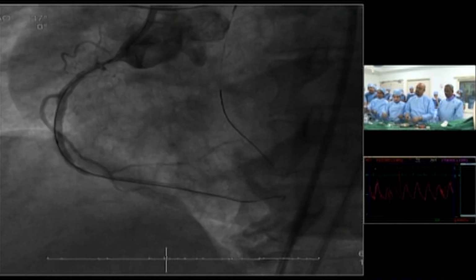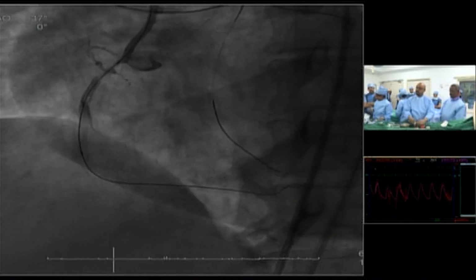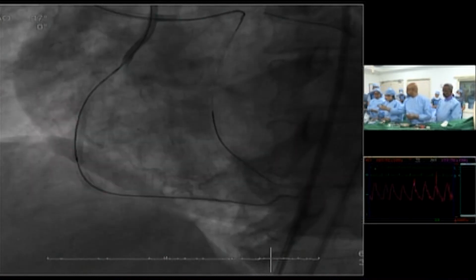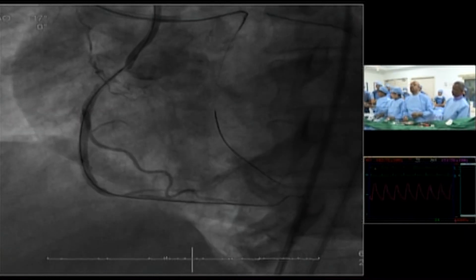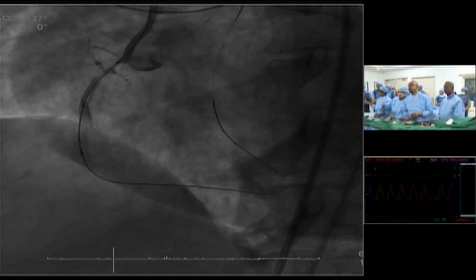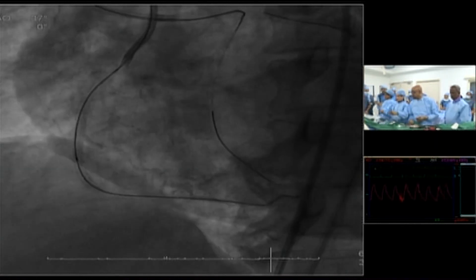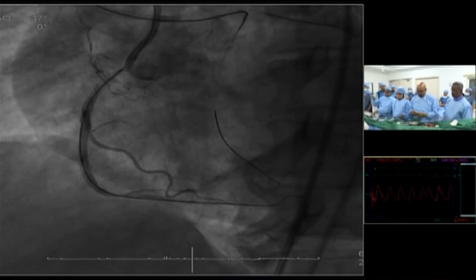So it's a mix. So probably we will finish the left also and come back and assess the right again. If it still shows the lesion, I would suggest start with the next stent for the ostial right. Then you have one vessel correct, at least done. Not start in two different places simultaneously. Put one stent more to the proximal right, and then we will see.